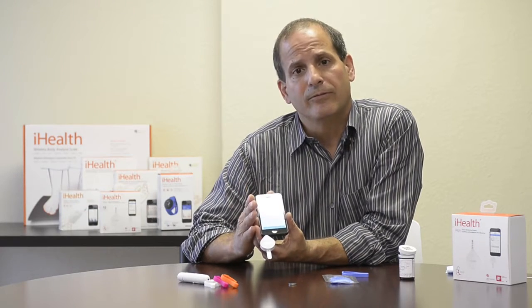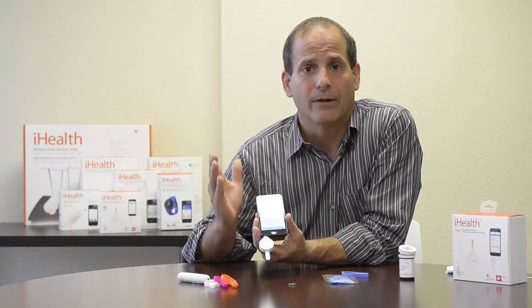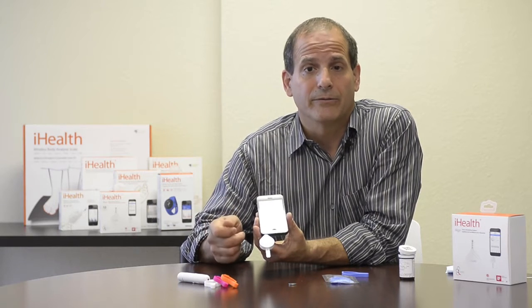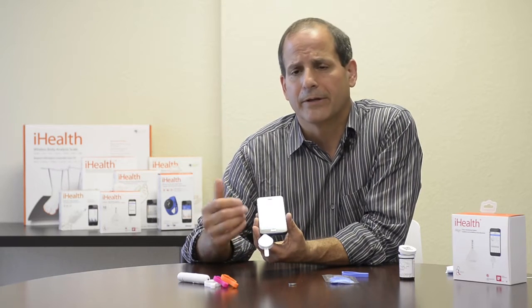Importantly, everything that goes to the mobile phone is also sent to the cloud automatically. I can log in online with a computer and see all of my information and trends. I can also share that information with caregivers, loved ones, or medical professionals, so all of my information is automatically stored on the phone and on the cloud.